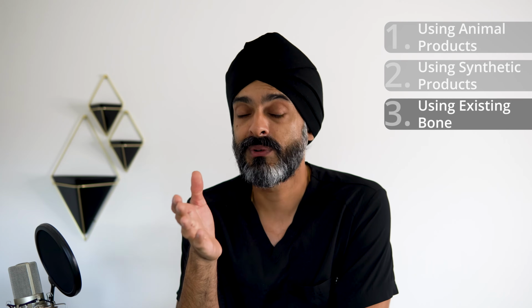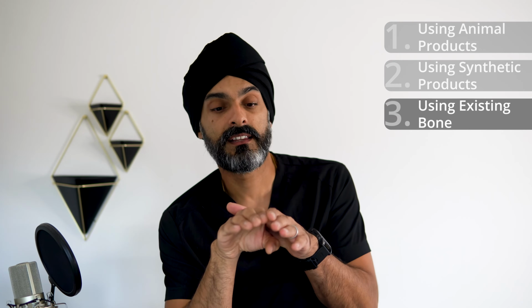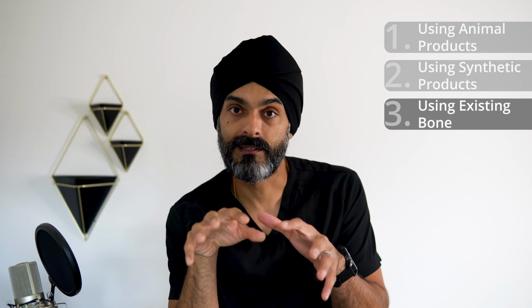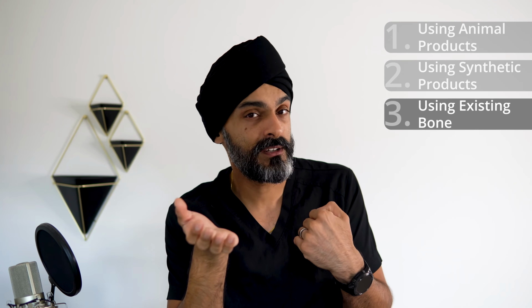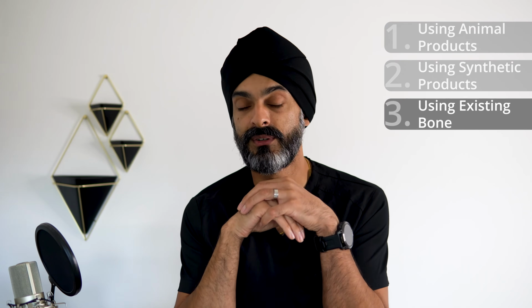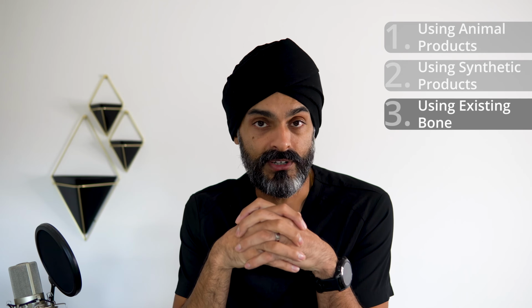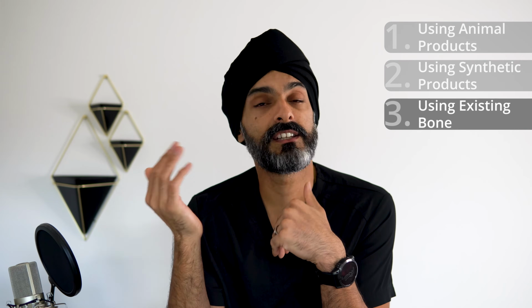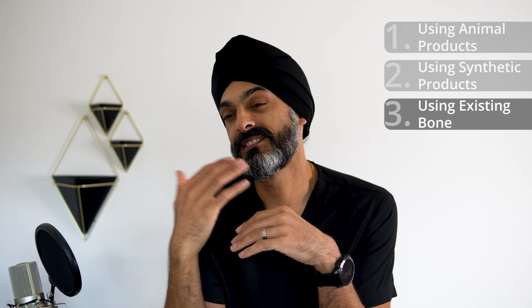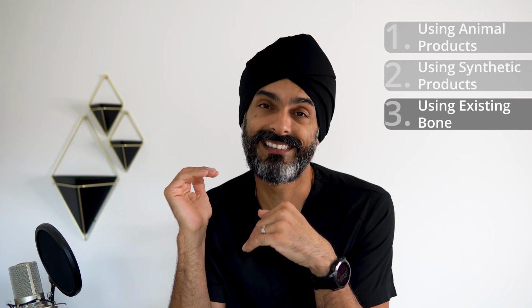And there's been situations in the past where we've used mainly a patient's own bone. We've had the wound open up a little bit, and we lose a bit of the graft, but the majority of it is still there. Okay, so this is probably my favorite type of bone graft, just because the success rates are high, and the chances of complications, or if you get a complication, the consequences are less.